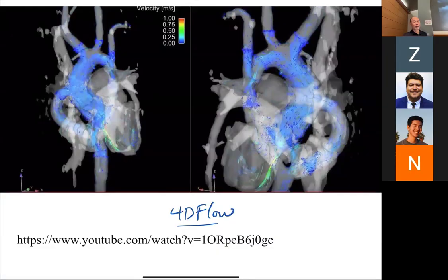Lots of industries have benefited from this, but medical imaging has benefited a lot, because, as you've seen with the recon and everything, there's a lot of computation that goes on. With each generation of magnets or MRI systems we get, we see there are more GPUs. So when you're getting your scan done and you get these images, you have the video gaming industry to thank for that, because without that pressure, I don't know if the GPUs would have been developed. Okay.